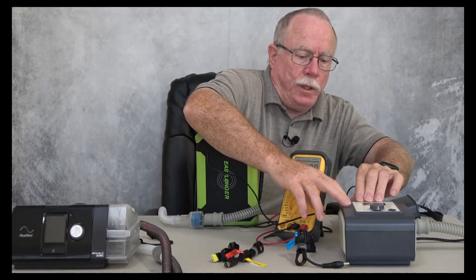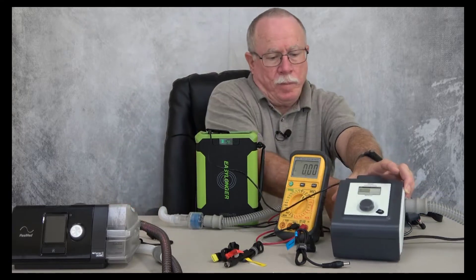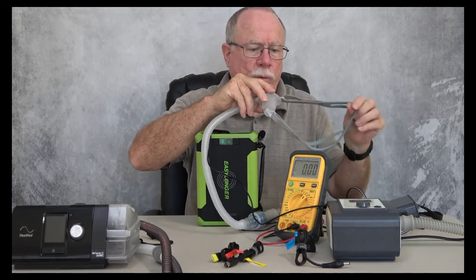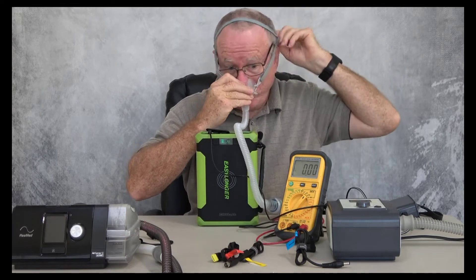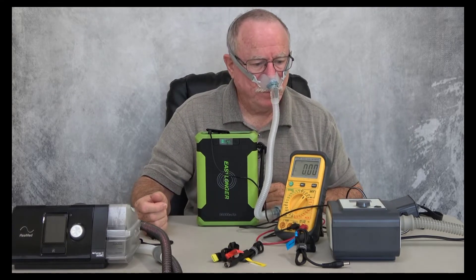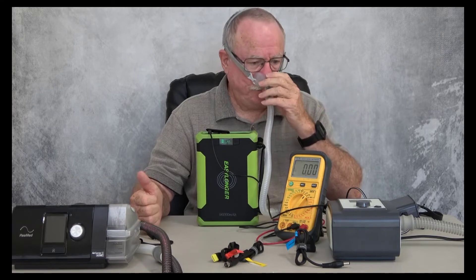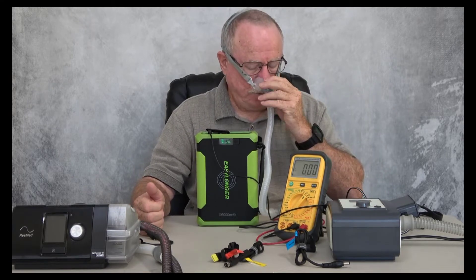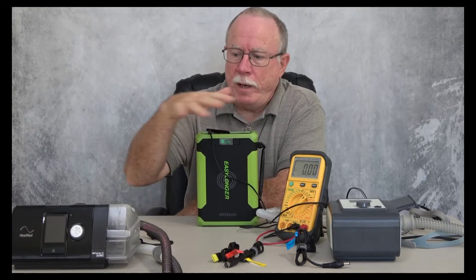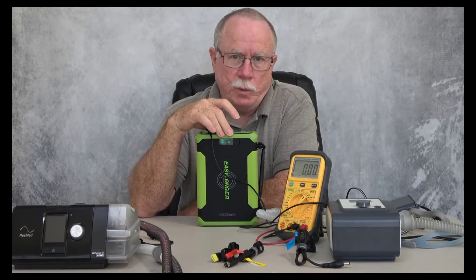Now I should be able to plug this into my Rimstar machine and have it work. We've tested that output, verified that it was 12 volts. We're going to connect it into the machine, and you can see the machine display comes on. There it is — it's working. We've powered two different machines at two different voltages using the selectable voltage on the EZLonger battery.